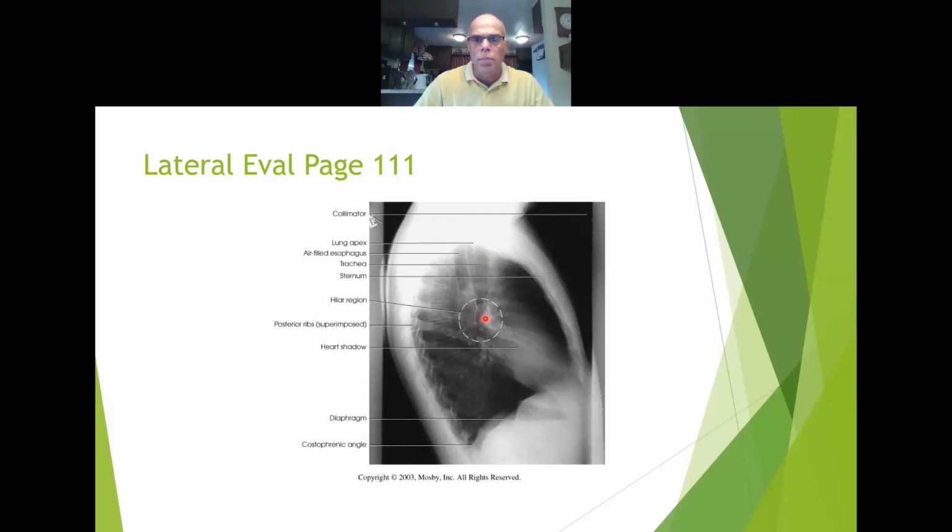There's one of your main bronchi on in. Remember, we're looking into that tube, into that bronchial, because it's a tube. We're looking in it from the lateral side, so we're looking in like it's a straw. Costophrenic angles and the portions of the pulmonary apices are not obstructed. Apices, costophrenic angles cleared, no problems.